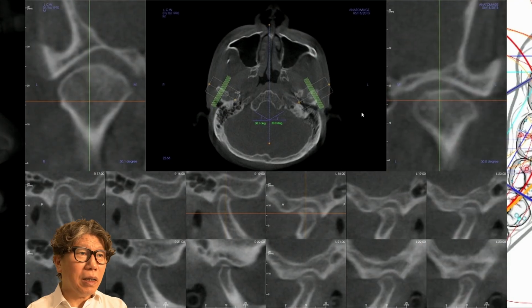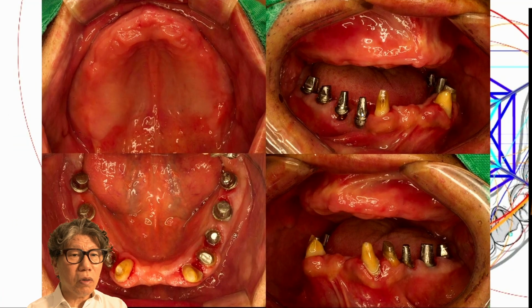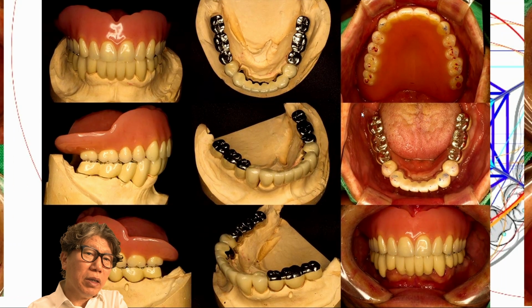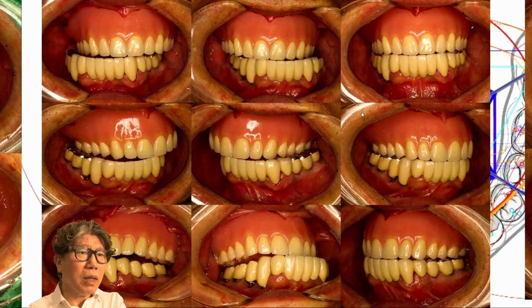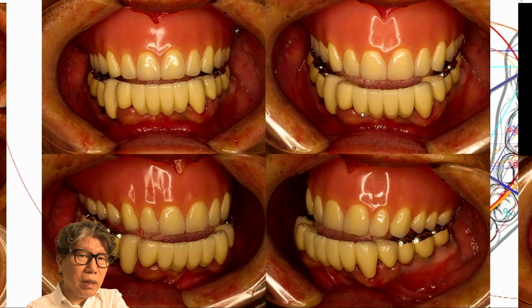All on X makes no sense. The TMJ is healthy. So it's okay. The prosthesis has been removed, and then the maxilla is restored with a full denture, while the mandible is constructed with a fixed bridge. It fits perfectly once you put it in your mouth. Centric contact and eccentric contact. So it seems he's been using it for about 15 years as well. I am using it well without any problems. I have been practicing dentistry in one place for over 30 years. So, if this treatment becomes problematic, it could be a serious issue.